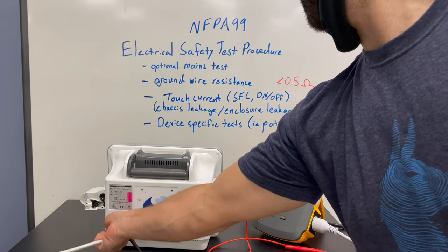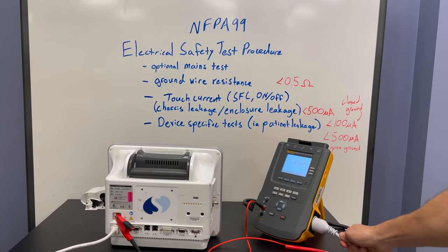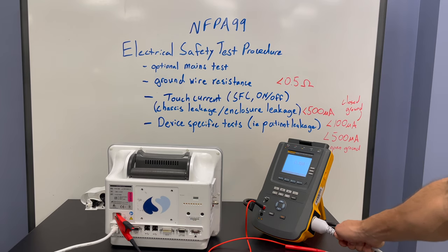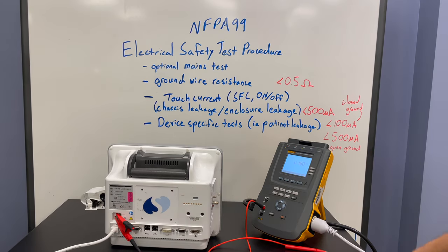We need to make sure we test the strain reliefs as well, checking for large variations. You can see some significant variations here, and I've noticed that a lot of these Space Labs power cables do have significant variation and many tend to fail right at that point. But we are still under the 0.5 ohm resistance level, so that does pass.